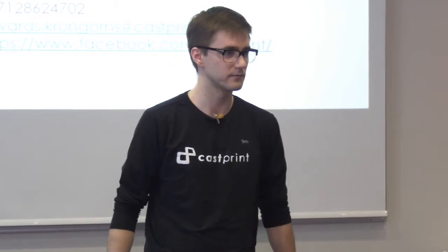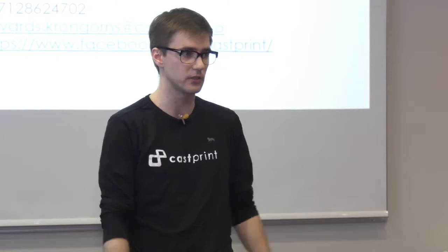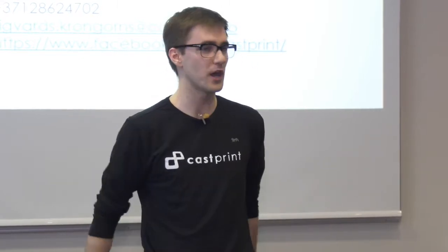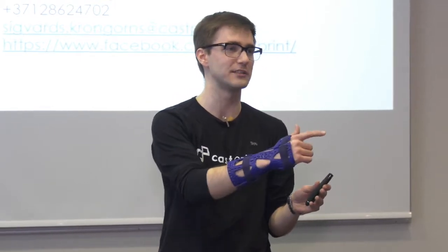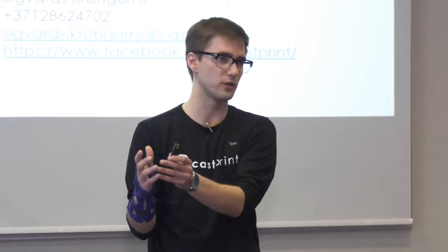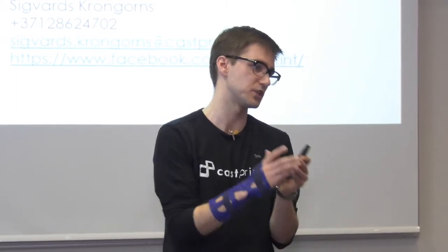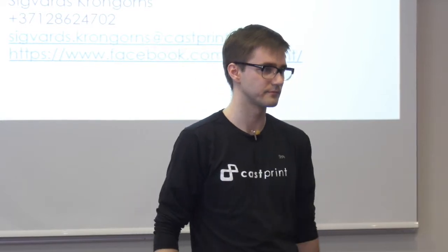Where are the casts actually printed? In your office or? Yeah, currently, back in Latvia, when we started out, we had our own printers on site in order to keep it in-house and learn more. But in order to expand, it wouldn't be feasible to print just in-house. So we are developing a platform where, when the hospital orders, they initially go through us by creating this model. Afterwards, we directly relate them to a regional printing hub. For example, when you have an order from Finland, the model is created in Latvia, and then it's directed to the nearest 3D printing center in Finland, which prints it according to our recipe and ships it to the hospital, to keep costs at a minimum. Is scanning done by the hospital? Yeah, it's done by the hospital. We provide the training, technical support and that sort of thing.